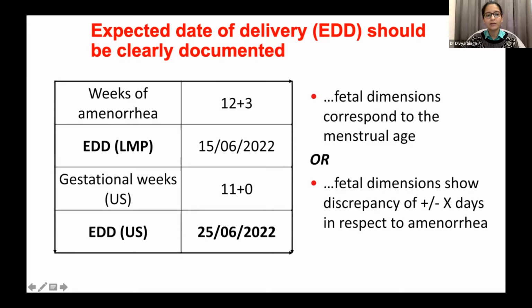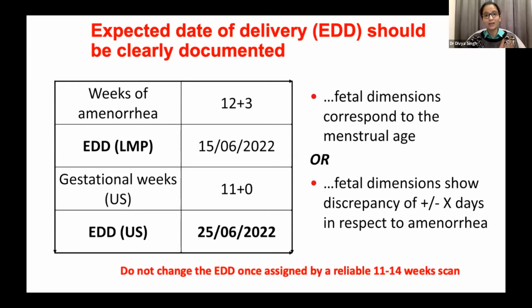And so we would give her an estimated date of delivery based on the ultrasound, which would come out to be 25th June, 2022. So one should always document the expected date of delivery, whether calculated by LMP or by the CRL, clearly in the report. And once you've done this at the time of the 11-14 week scan, if you've done a proper scan or you see a reliable scan, do not change the EDD on her subsequent visits.